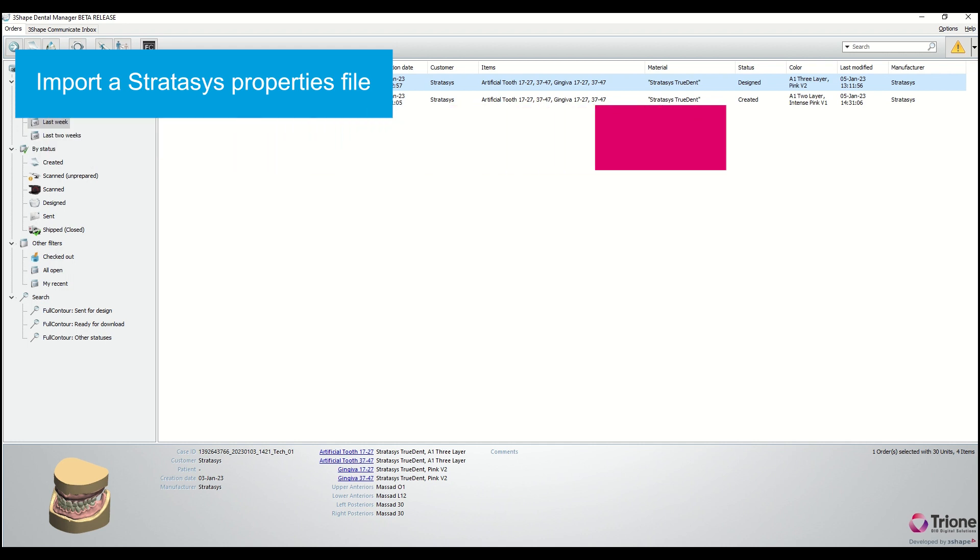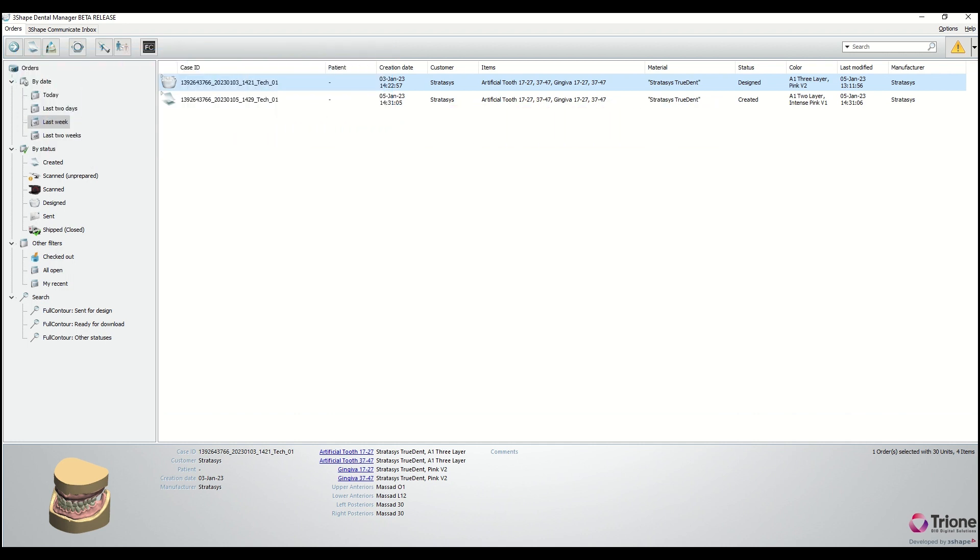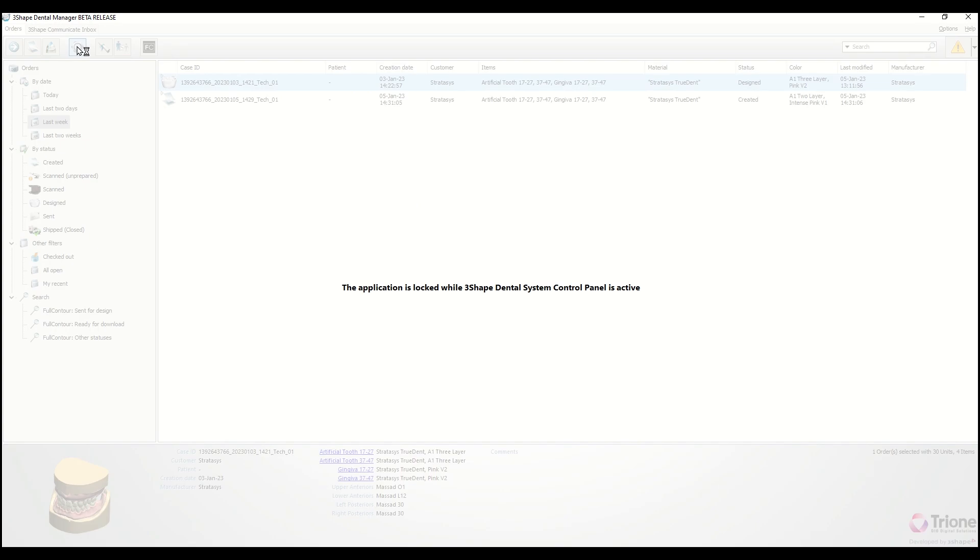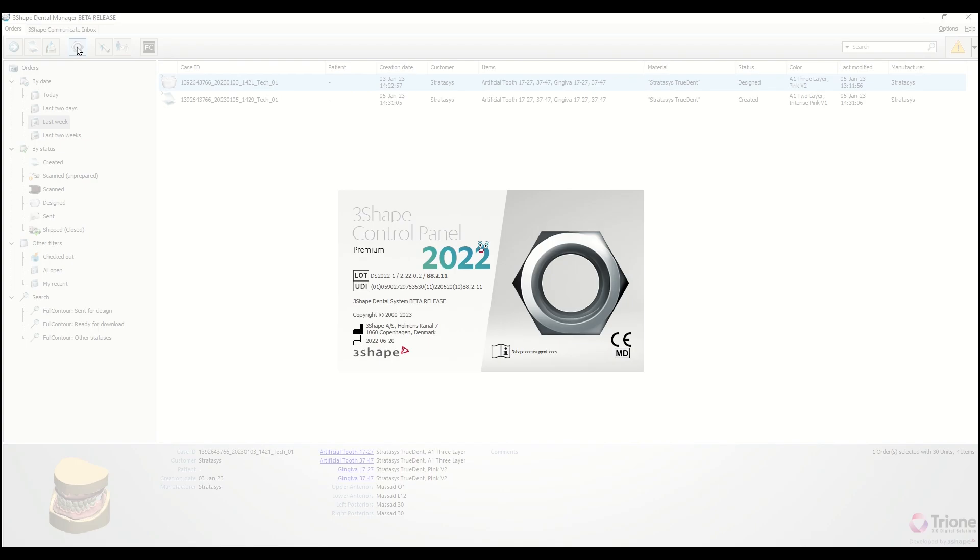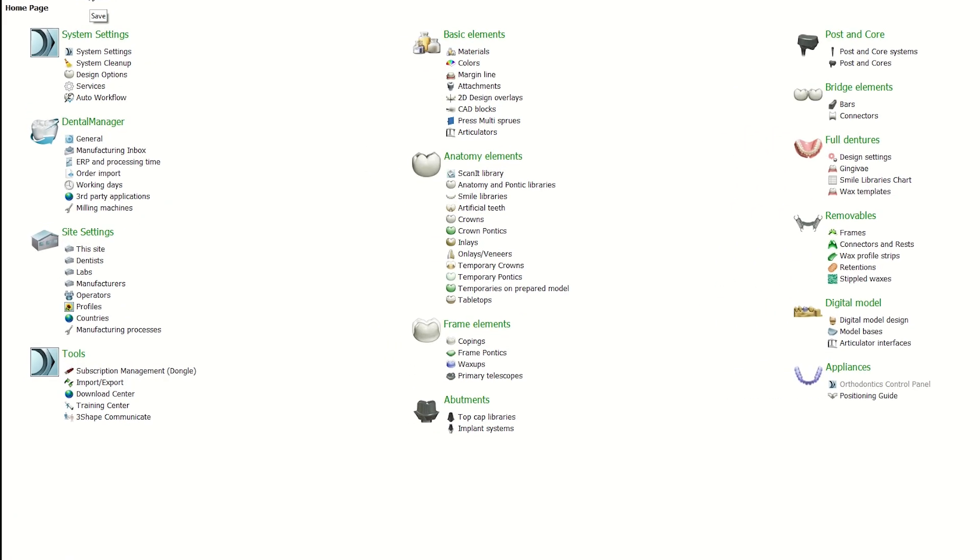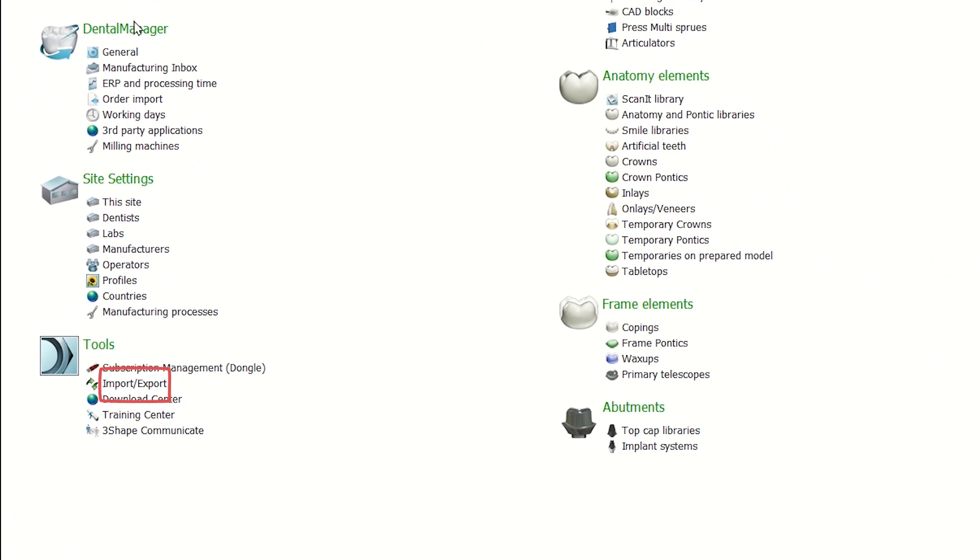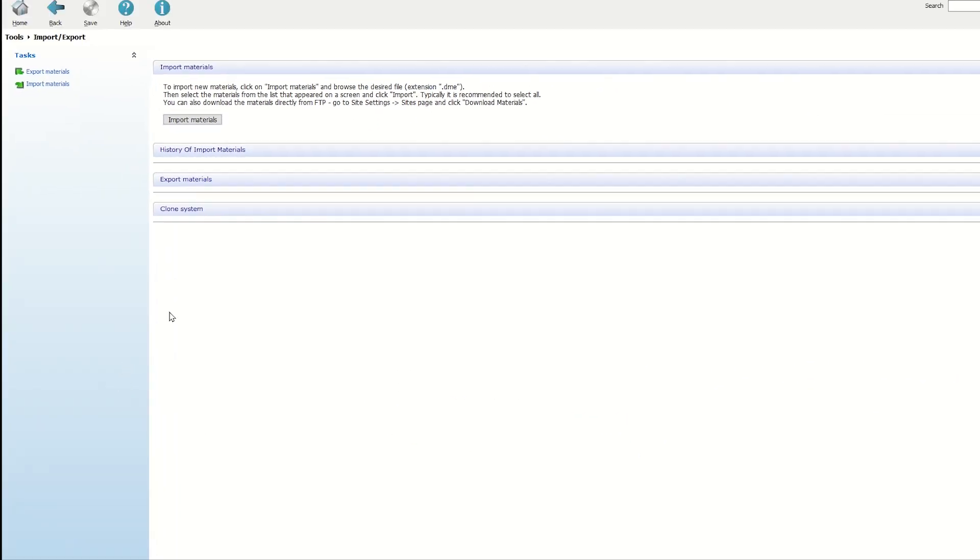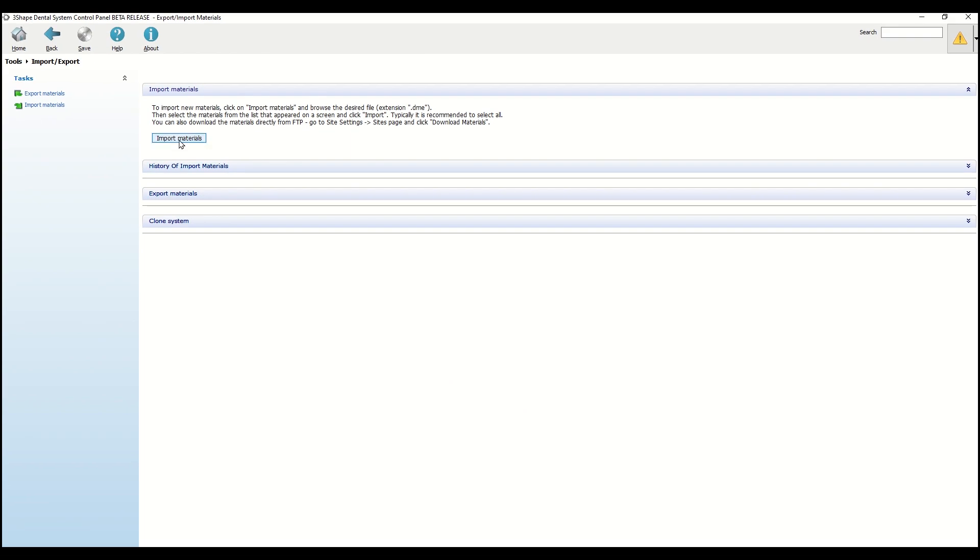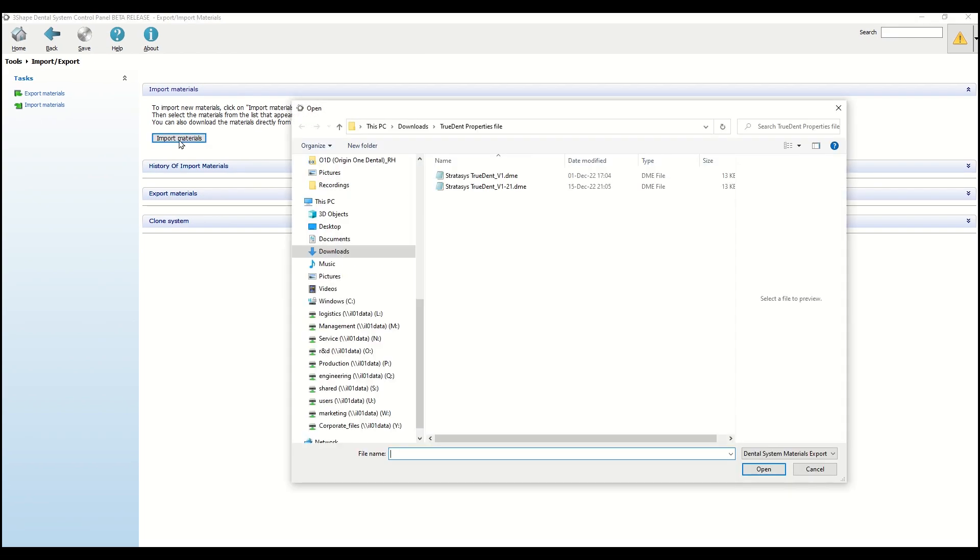First, you will need to import the Stratasys properties file into 3Shape Dental System control panel. Open the control panel, select import and export, then import materials.